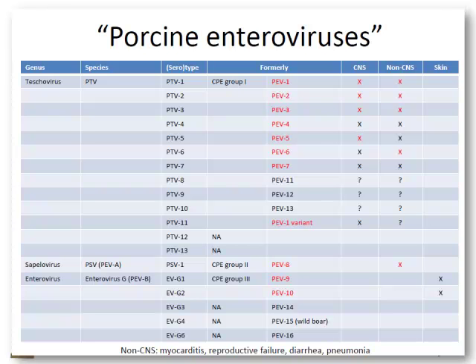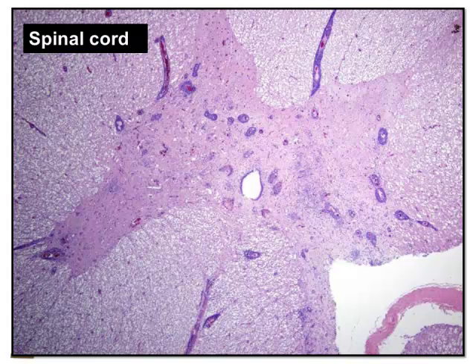And the thing is, everybody forgets to submit the spinal cord when this is potentially a differential. And why? Because you can get severe myelitis. Well, I don't expect you to know what's going on here. But basically, all the blue is inflammatory cells, and that's definitely not good when you're dealing with CNS disease. So how often do we see this? Maybe a question.